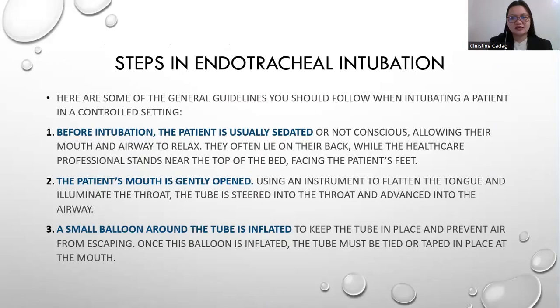Next are the steps in endotracheal intubation. Before intubation, the patient is usually sedated or not conscious, allowing their mouth and airway to relax. They often lie on their back while the healthcare professional stands near the top of the bed facing the patient's feet. So the physician or the doctor will position himself near the top of the bed for easier visualization of the trachea during intubation. The patient's mouth is gently opened using an instrument to flatten the tongue and illuminate the throat.